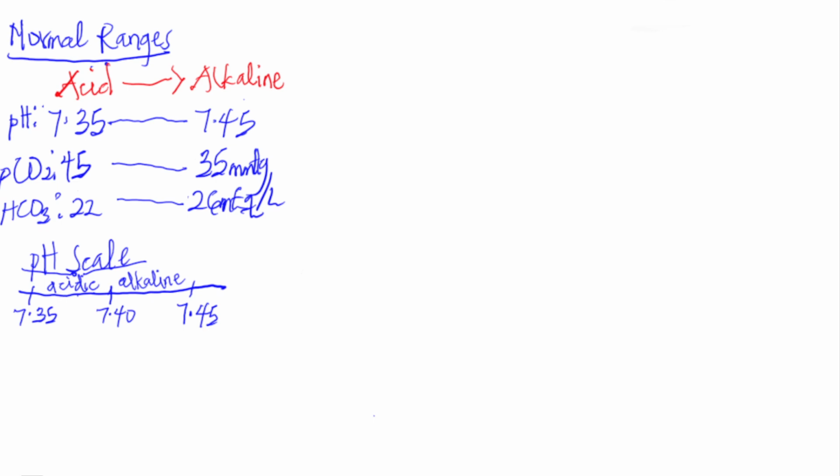So someone may ask, in case you as a doctor or a clinician or anyone at all are given the ABG test results and asked to interpret. Normally, we interpret based on whether the person has acidosis or alkalosis. And the acidosis or alkalosis can be said in terms of whether it's metabolic or respiratory. We know the byproduct of respiration is what? Carbon dioxide. So the partial pressure of carbon dioxide here is the respiratory component.